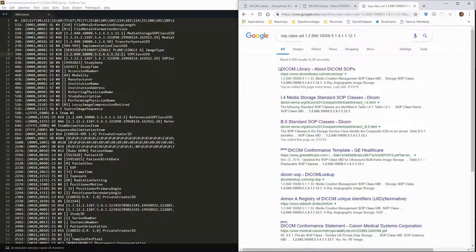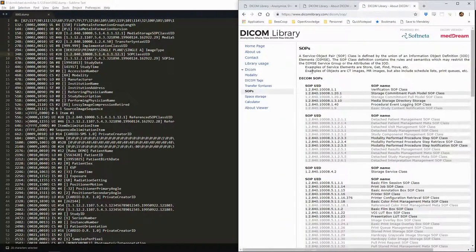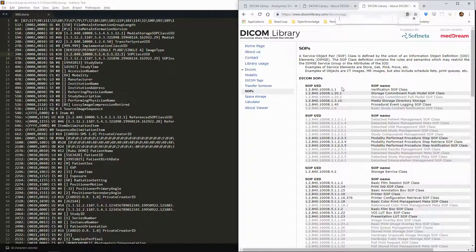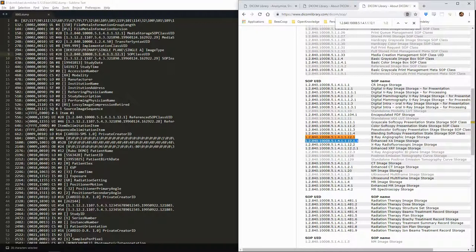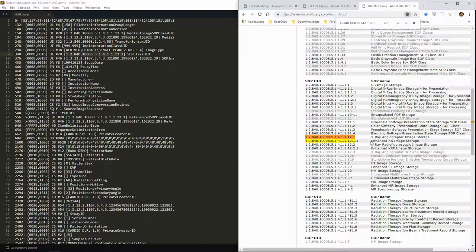We can also check the SOP class UID. In this case, we see that it corresponds to an X-ray angiographic image storage. We can easily find the list of all the UIDs online.